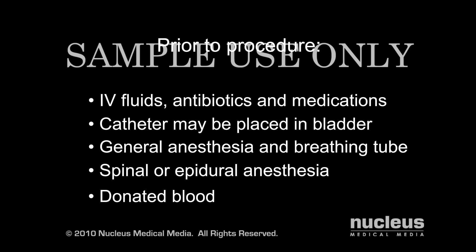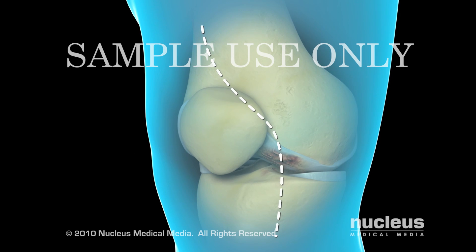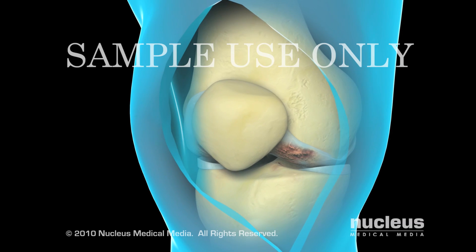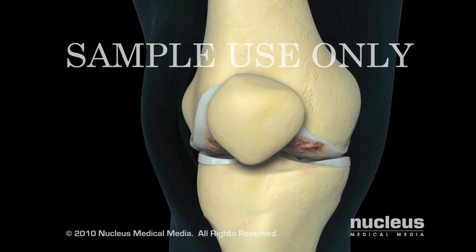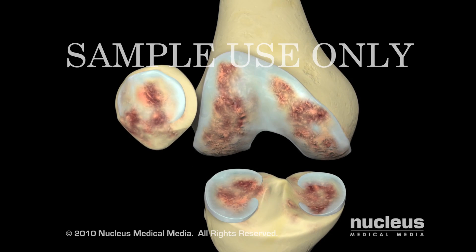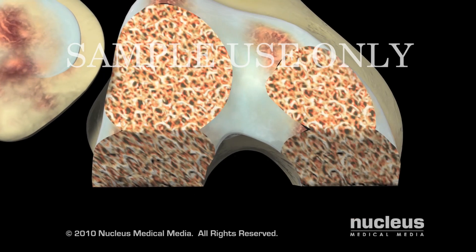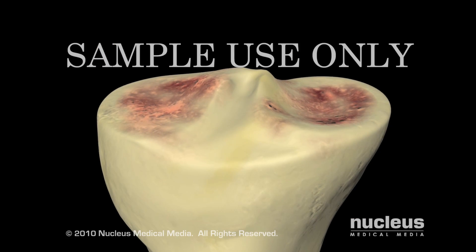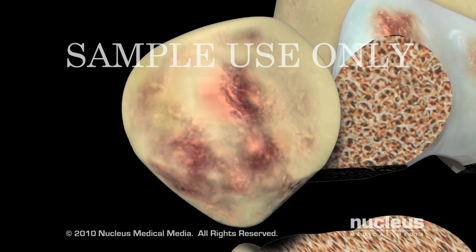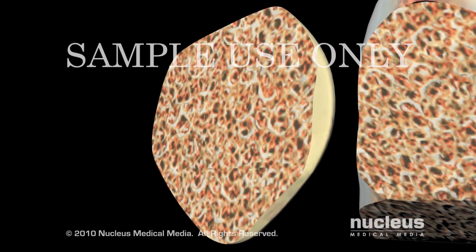Most total knee replacements take approximately two hours. Your surgeon will begin by making an incision along the front edge of your knee. After separating the muscles and ligaments around your knee, your surgeon will incise the knee capsule to gain access to the inside of the joint. Using specialized tools, your surgeon will remove the damaged bone and cartilage on the ends of the femur and the tibia, and in most cases, remove the underside of the patella. Your surgeon will then prepare the remaining bone to receive your new prosthetic knee.